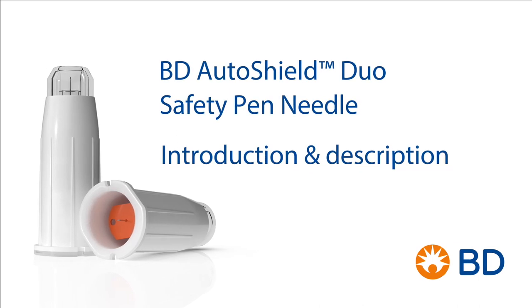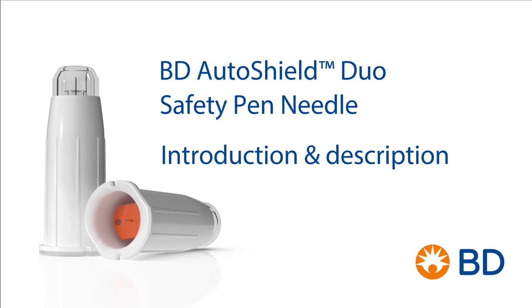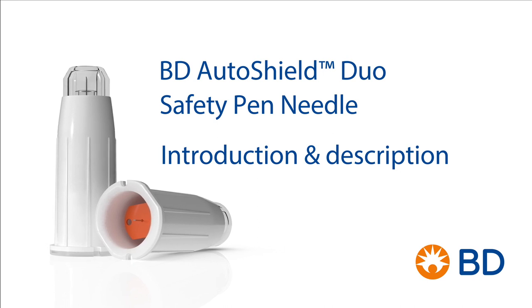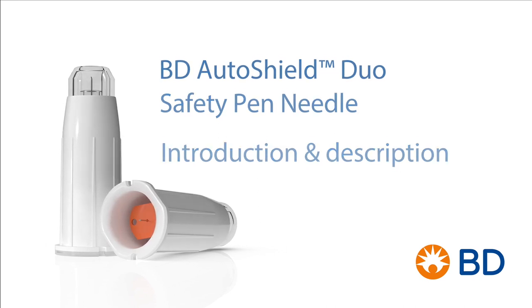This video guide outlines the proper steps for performing an injection with the BD AutoShield Duo Safety Pen Needle and helpful injection tips for frequently asked questions.